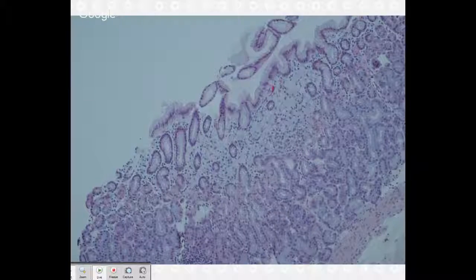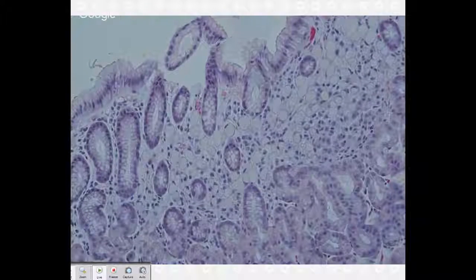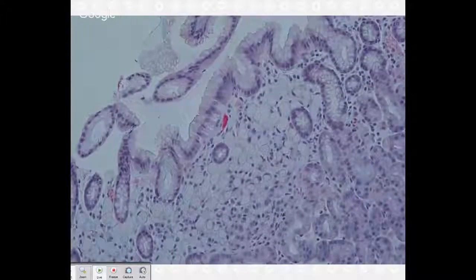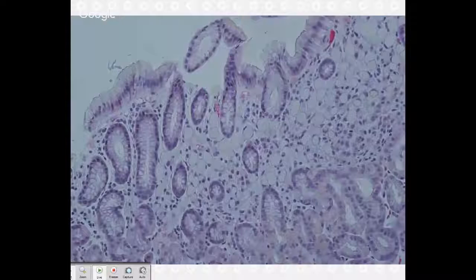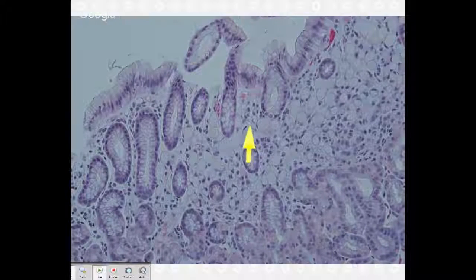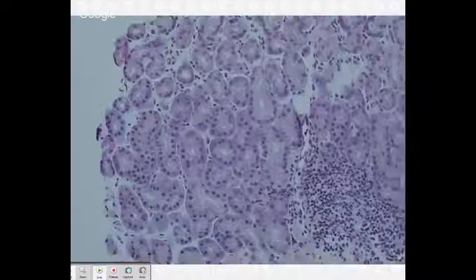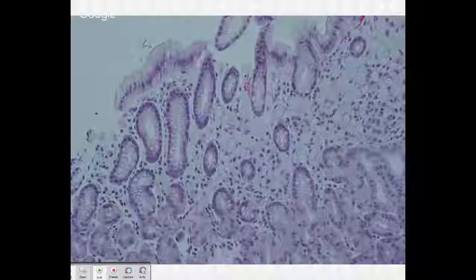Yep, right there, right? I don't know how many tissue sections are on this slide, 6 or 7. And we have this one biopsy that has these super sneaky signet ring cells just up here, just hanging out in the lamina propria. It would be so easy to miss them. Now she's 35 and she has breast cancer.